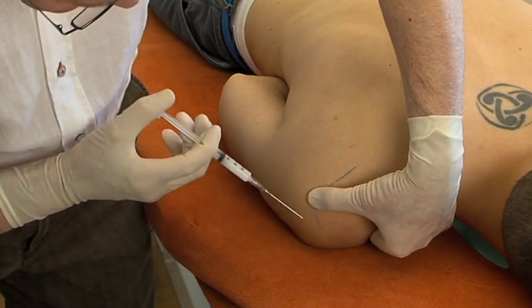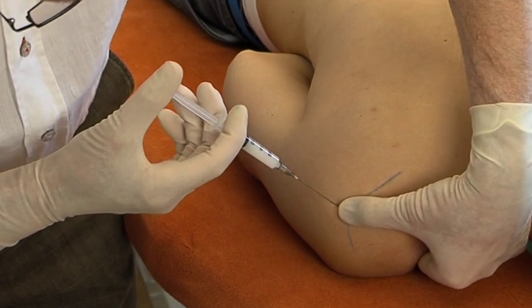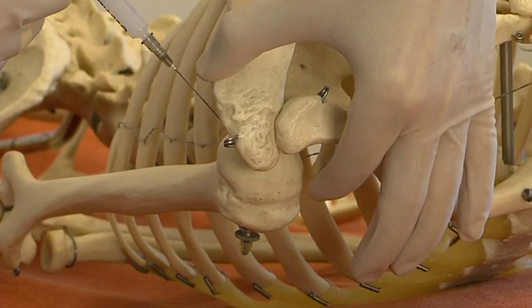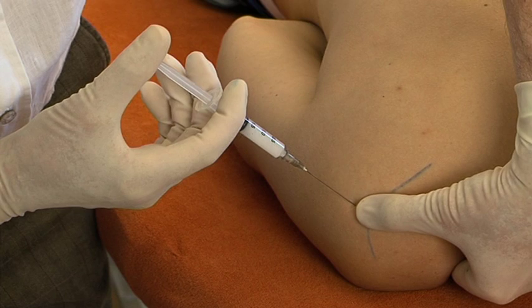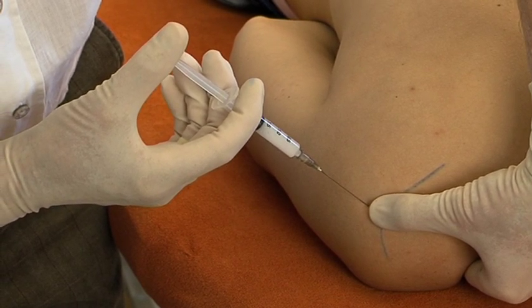The needle is thrust in just underneath the thumb, aimed at a point just lateral to the coracoid process. The first resistance is felt when piercing the capsule of the joint, a second one on impingement against the articular cartilage. Now the intra-articular injection is given.